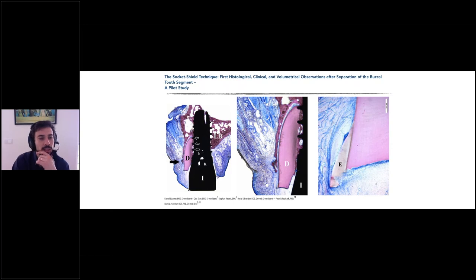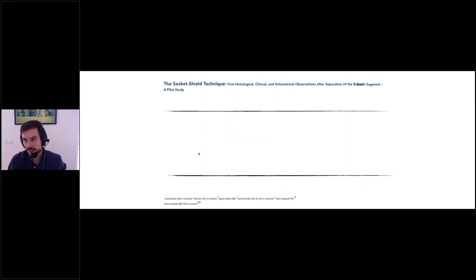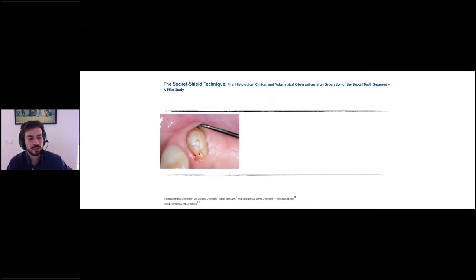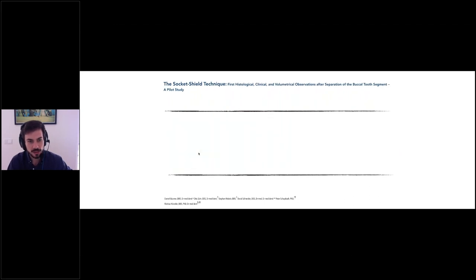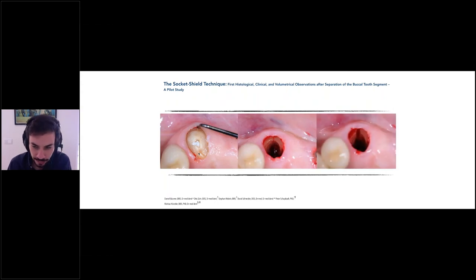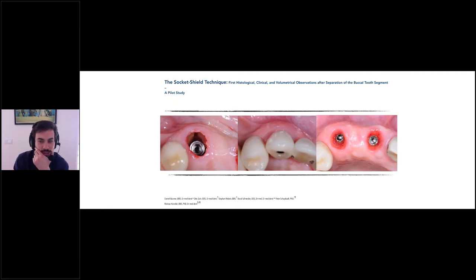What the literature is telling us is to leave our root in relation with the bone. So this is another animal study. I'm going a little bit fast now. In this study, they proved too that socket shield could be applied on a tooth with a vertical fracture. They opened the fracture to allow the coagulum to go inside the defect on the tooth, and not only the bacteria, that would be a problem, as you can see here. And the case has a really, really nice outcome.